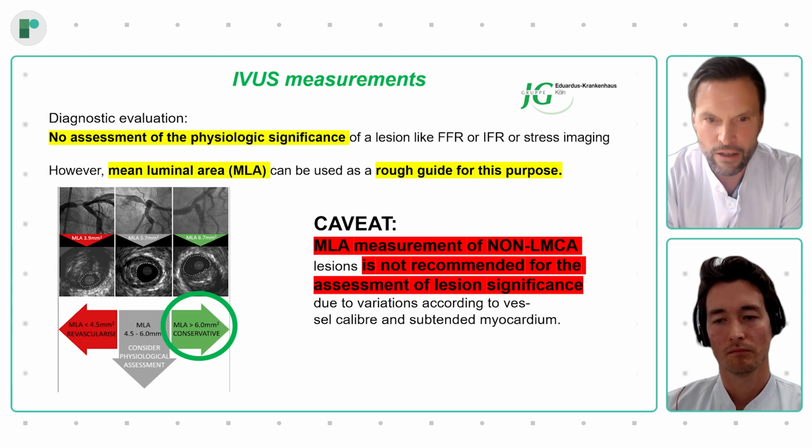I think nobody would have implanted a 4.5 millimeter stent in this proximal LAD. And this is the advantage of intravascular imaging. It's a very good example that you found two very important aspects of the underlying pathology with a significant impact on treatment.